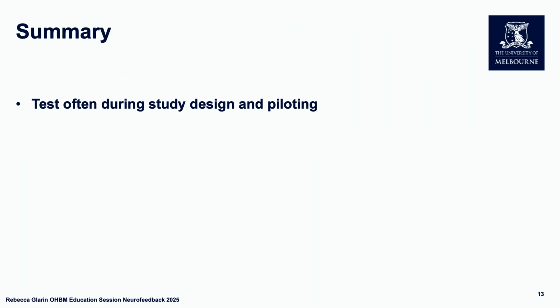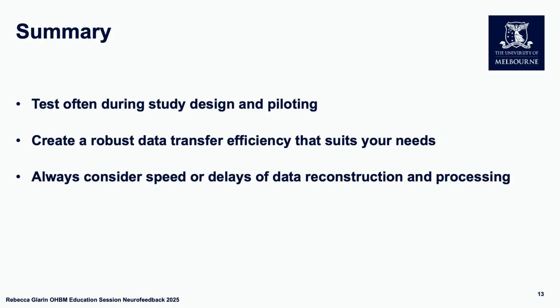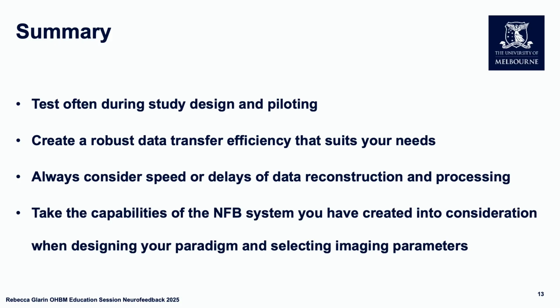So in summary, test often during your study design and your piloting. Can't emphasise that enough. Create a really robust data transfer efficiency setup that suits your needs. What we've presented today might not be what you need for your scanner, but take your time to have it how you need it. Consider the speed of your transfer and the delays on the reconstruction and the processing side, and take the capabilities of your system you've created into consideration when designing your paradigm and your parameters.